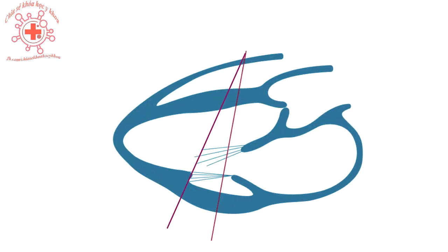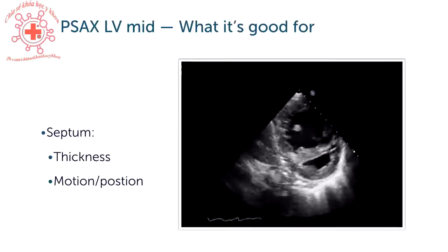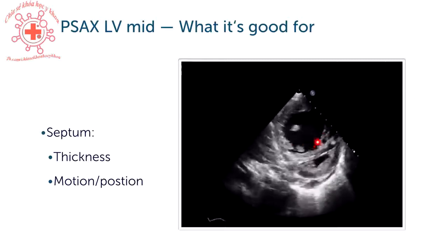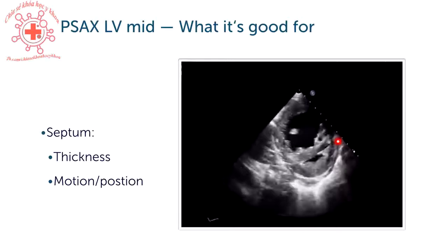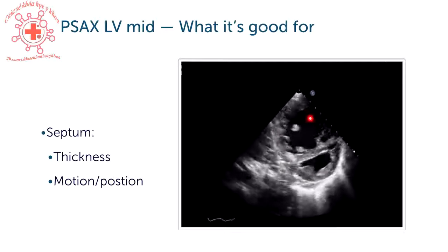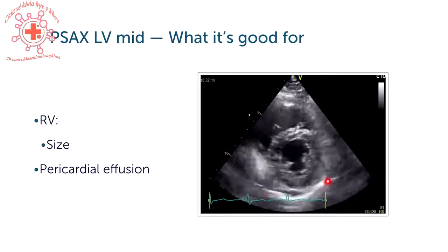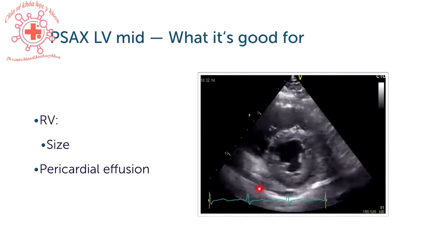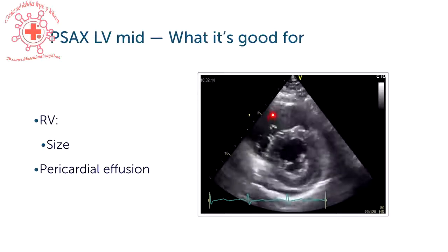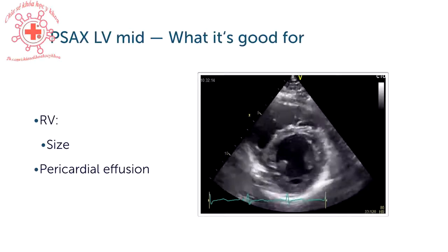The short axis view is ideal to look at the septum and its position. Here you have septal flattening in a patient with severe pulmonary hypertension — this is not a normal echo. In addition, you can assess the thickness of the myocardium, especially the septum and also of the right ventricle. Furthermore, the parasternal short axis view at the level of the ventricle is good for detecting pericardial effusion — here you see a very small effusion right in the inferior part of the heart. It is also possible to look at the relationship between the right ventricle and the left ventricle.